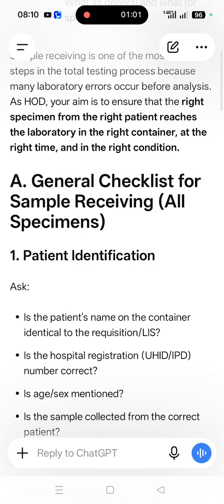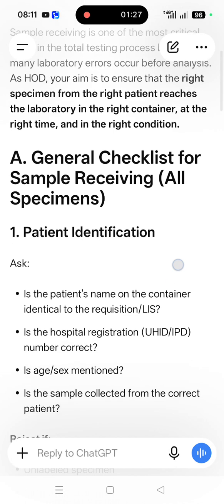So this is very, very important because for microbiology, contamination should not be there. At each and every step we have to see that it should be a pure thing, and it should be a sample from which we can isolate the pathogen. We don't want contaminants or commensals.